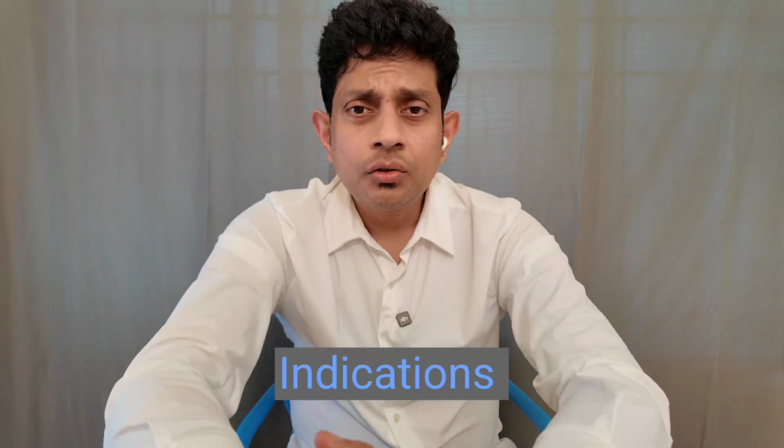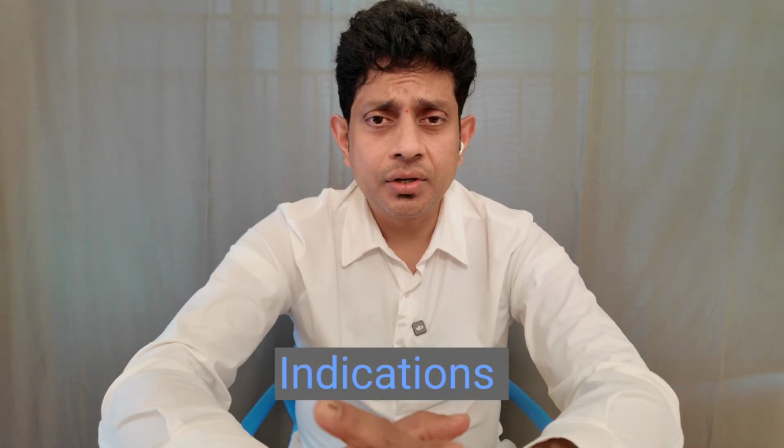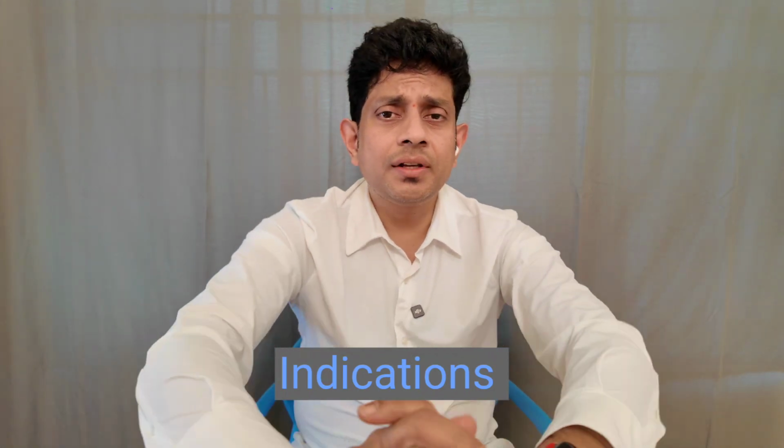Thank you. So what are the indications of permanent hemodialysis catheterization? I will give 5 indications. One, most important, is a patient with CKD who comes for the first time. If the finances and the patient are okay with a permanent catheter, and the patient does not have an AV fistula or AV graft, then permanent catheterization is the first preference, because the lumen is bigger, the flow is good, and there's a cuff, so the infection chances are less.